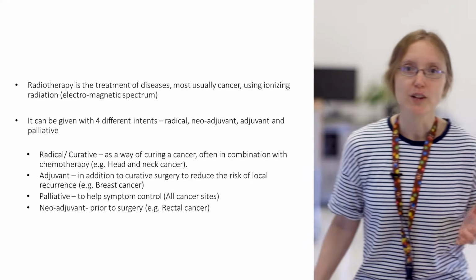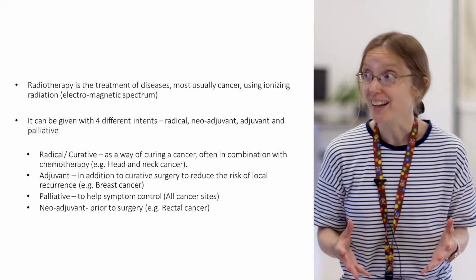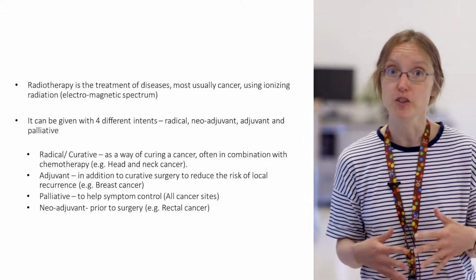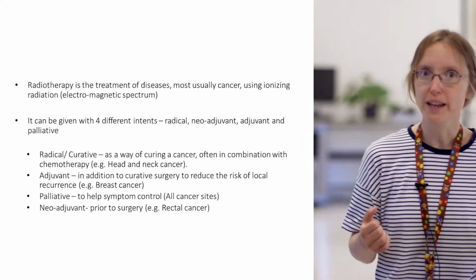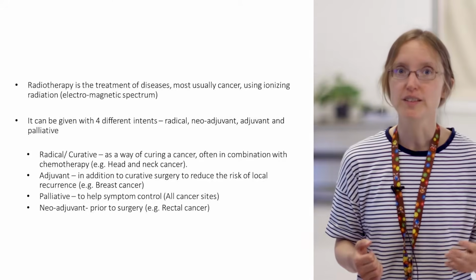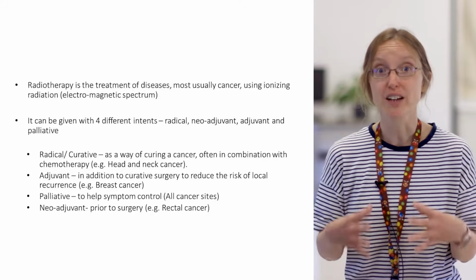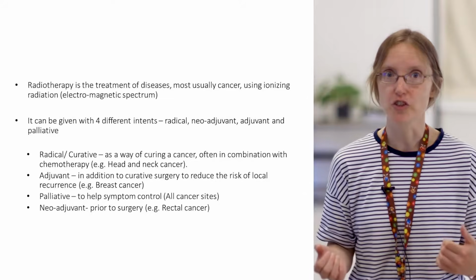So what is radiotherapy? Radiotherapy is the treatment of disease, mainly cancer, using ionizing radiation. Now, if you say to a patient, I'm going to give you radiotherapy, and they say to you, what's that, doctor? And you say, it's ionizing radiation, they'll start to look pale and quite unsettled. What I tell patients, and what you should tell patients, is radiotherapy is high energy X-ray treatment. All of our patients have had scans and X-rays before, and so that concept they can understand. So radiotherapy is high energy X-ray treatment.